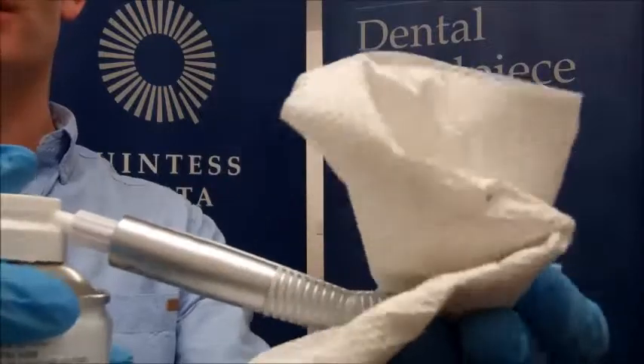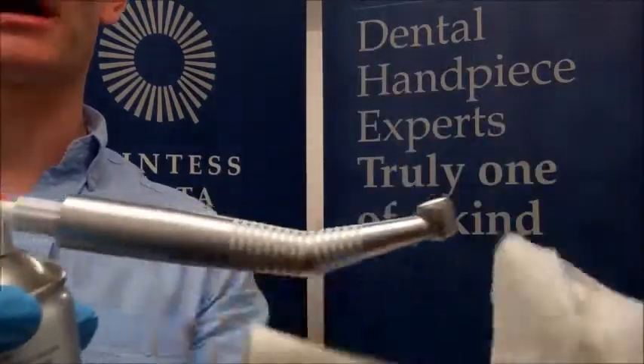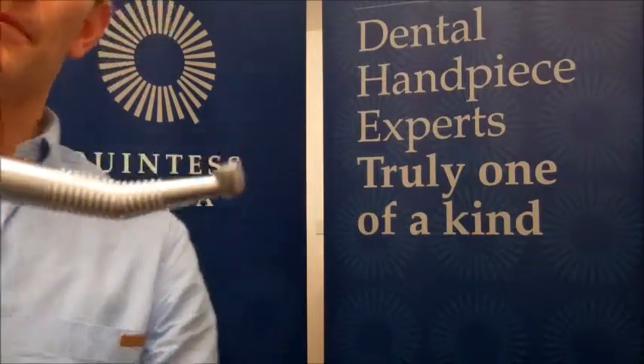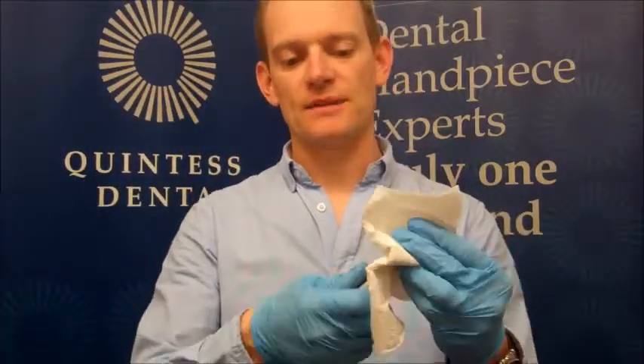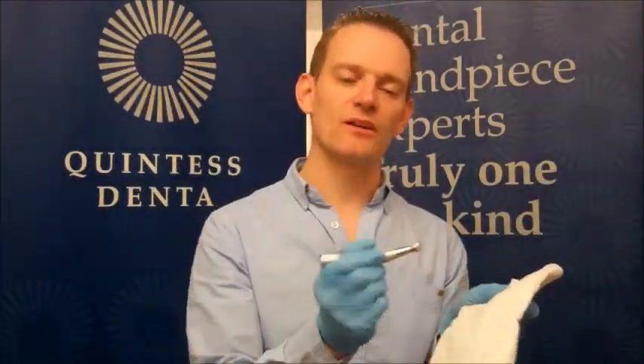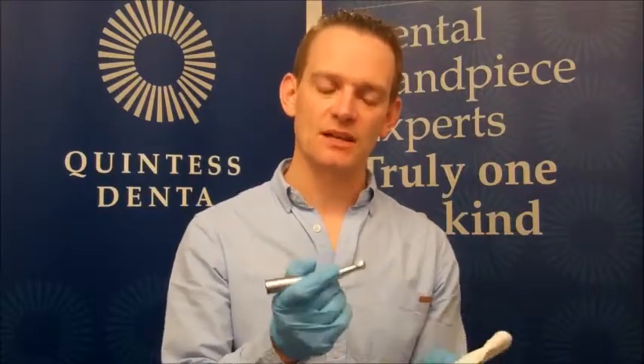You should see that oil has been emitted from the back cap and it should also be coming out at the burr. Remove the handpiece and wipe off any excess oil. If the oil on the cloth is in any way dirty, you need to repeat that procedure until what's coming out is clean. That's why you need to oil it for four to six seconds, to ensure that enough pressure has built up inside the handpiece to emit any dirt or debris.